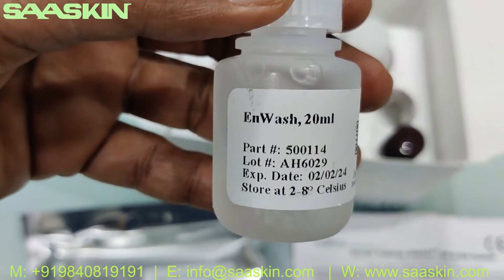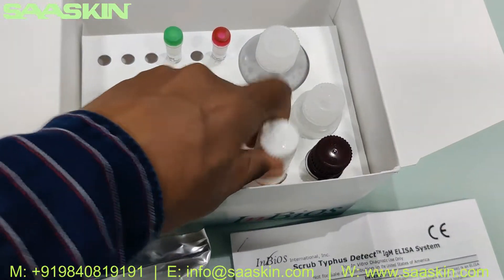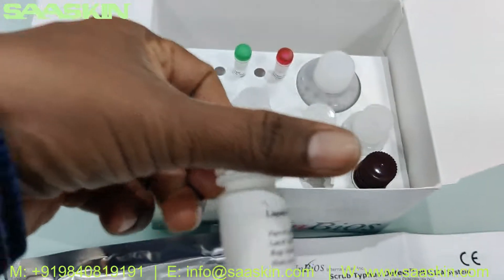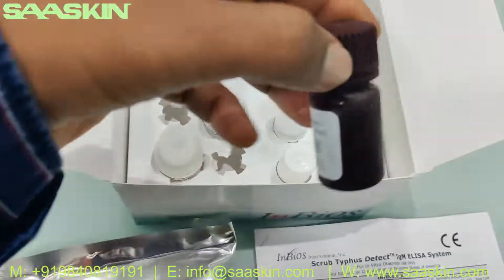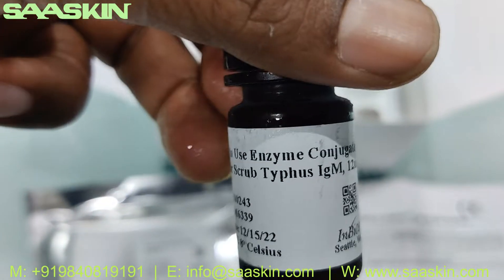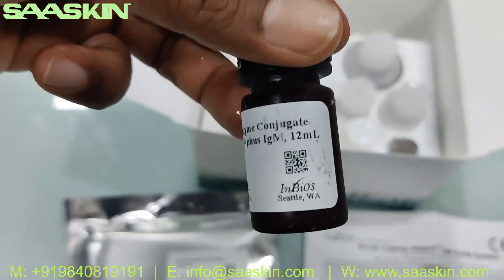This is the EnWash, 20 mL. This is the liquid TMB Substrate, 12 mL. And this is the Enzyme Conjugate HRP for Scrub Typhus IgM, 12 mL — this is the one we need to use in the assay.